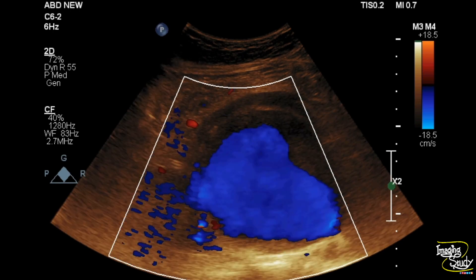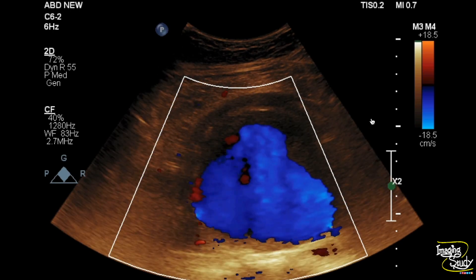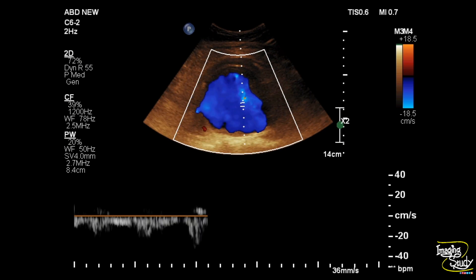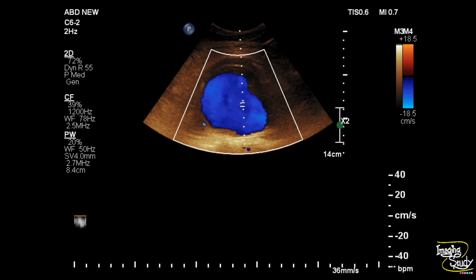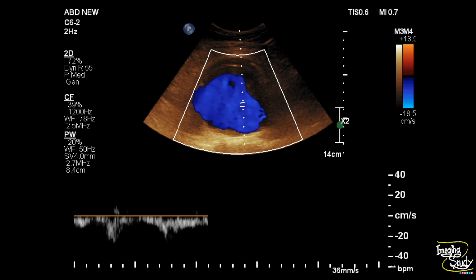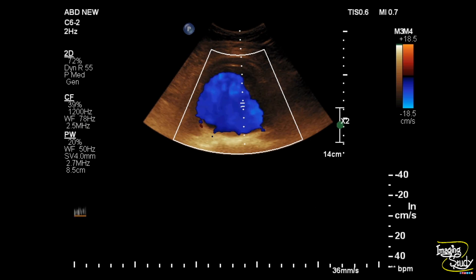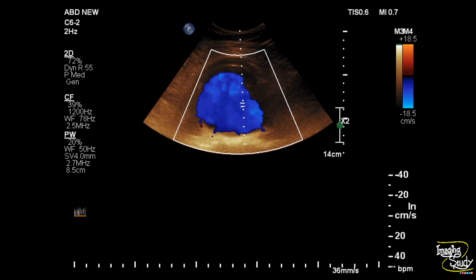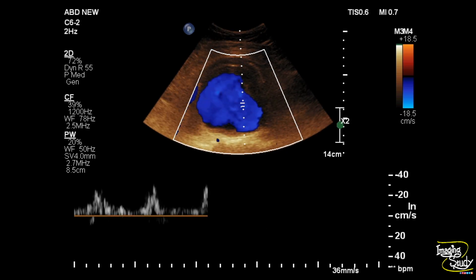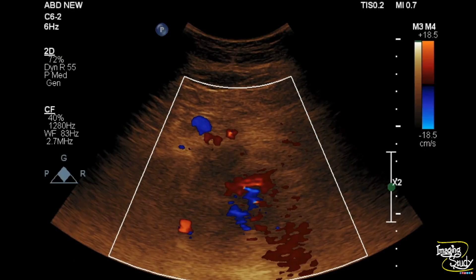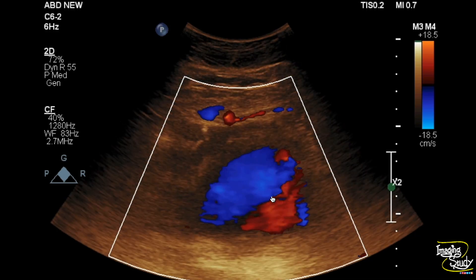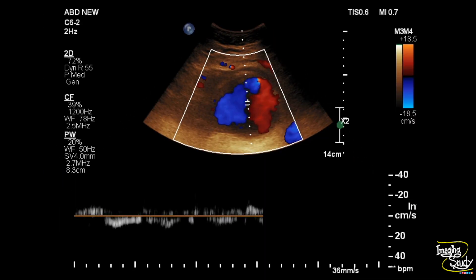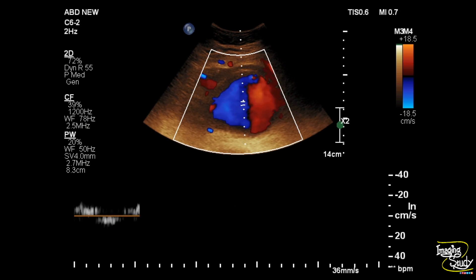Now we want to take the spectral Doppler. Here we have come to a lateral aspect and taken the spectrum, and you can see the spectrum shows some pulsation with not a good aortic wave pattern. We want to take the sample from the central part of the aneurysm, and here you can see it is showing a to-and-fro flow pattern, which is typical of an aneurysm.